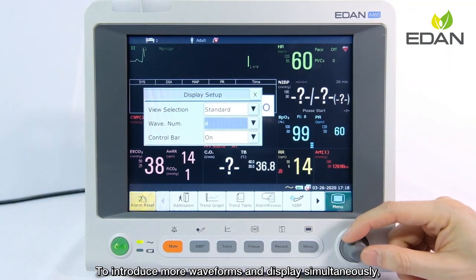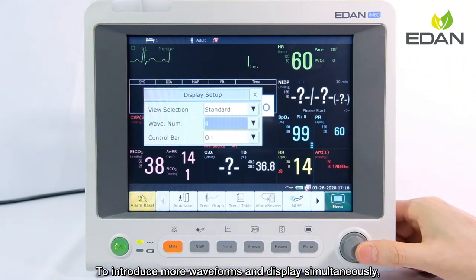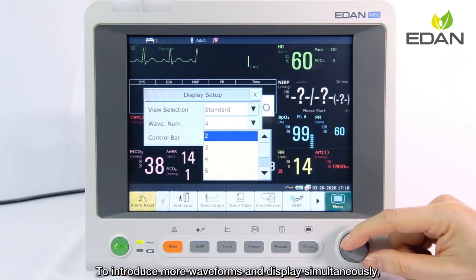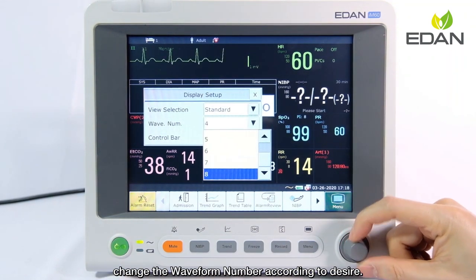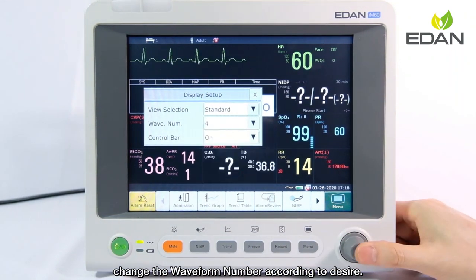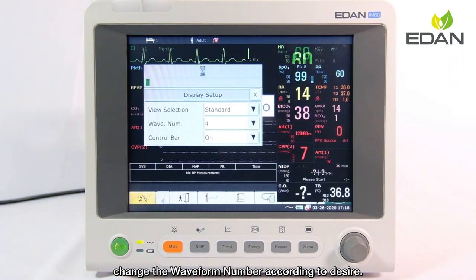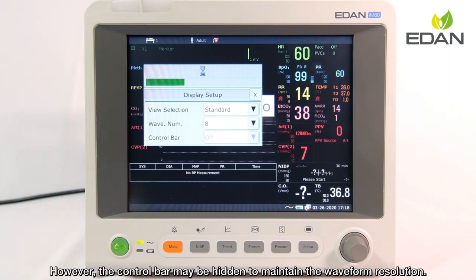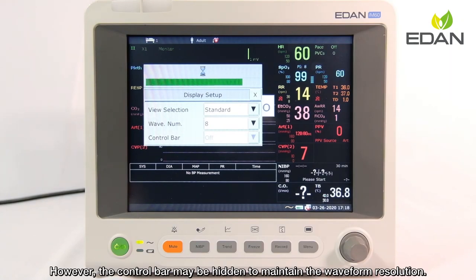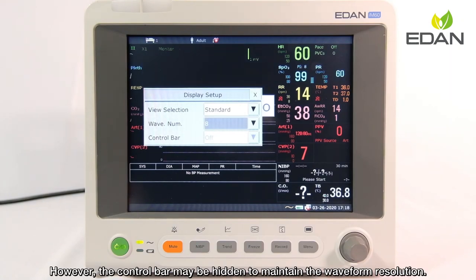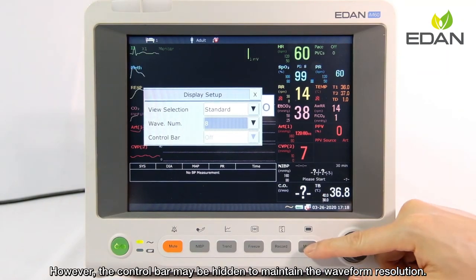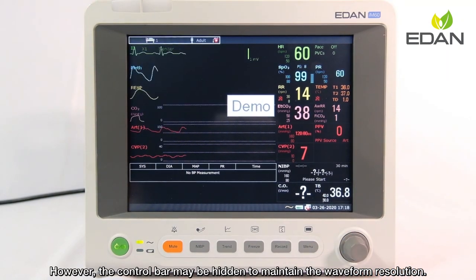To display more waveforms simultaneously, change the waveform number as desired. However, the control bar may be hidden to maintain the waveform resolution.